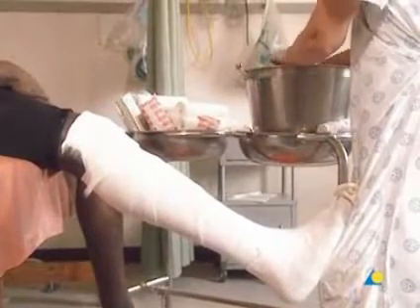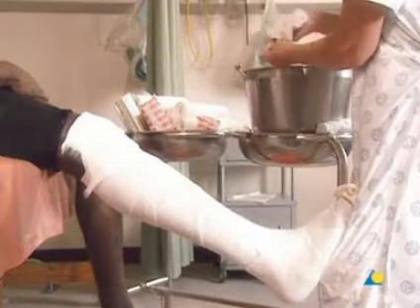The plaster bandage is wettened and the excess water is removed. Starting with the bottom of the foot, the plaster bandage is wrapped around the ankle in a figure of eight. The bandage is wound around the leg towards the knee with a 50% overlap.